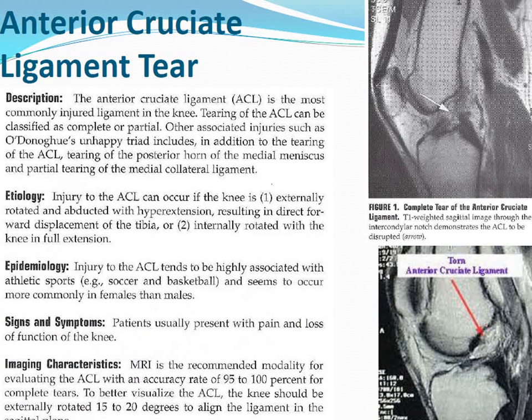This is something that you'll be doing MRI of the knee for quite frequently, an anterior cruciate ligament tear or ACL tear. They're quite common. You may know someone who's had one or had one yourself. They happen in athletes a lot. It's usually a twisting, pivot shift injury where the ligament, which takes an oblique angle, gets stressed and pulled off.